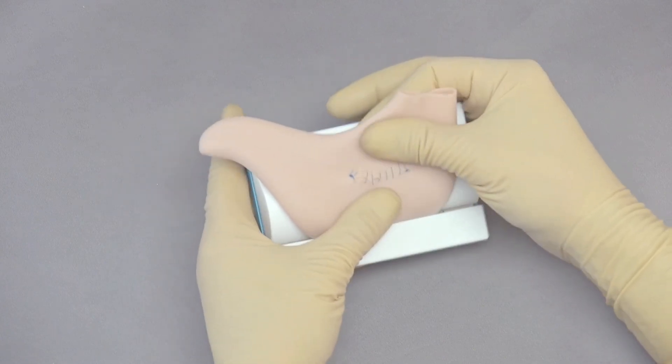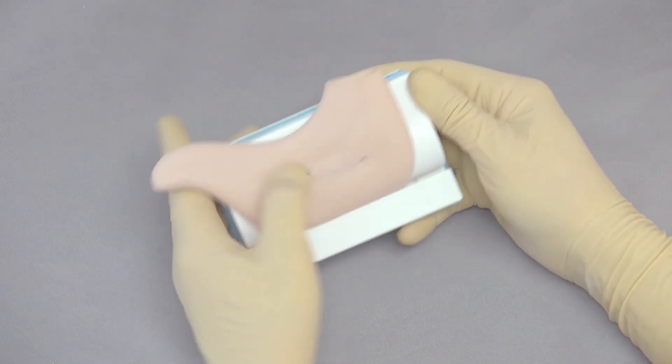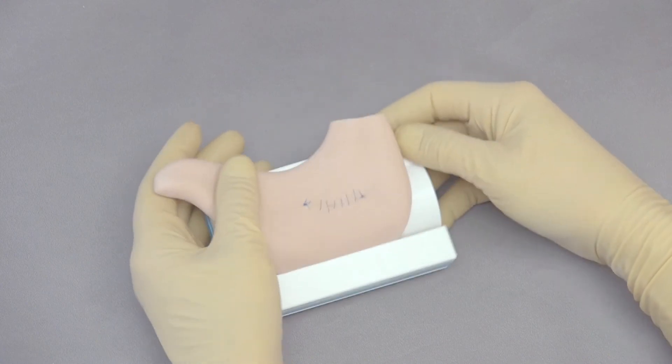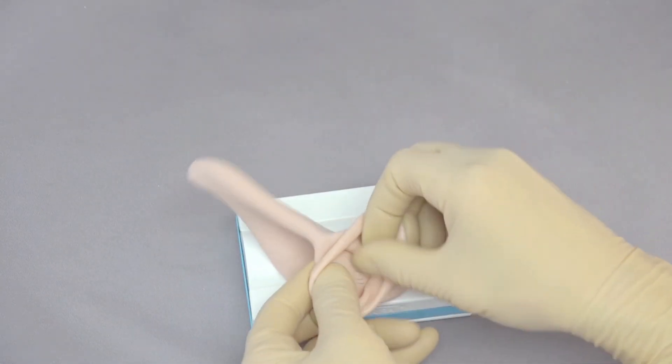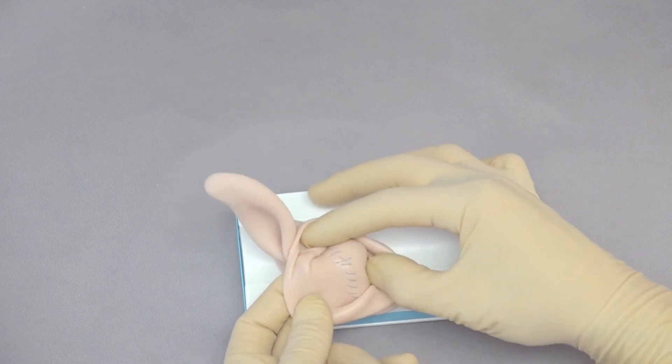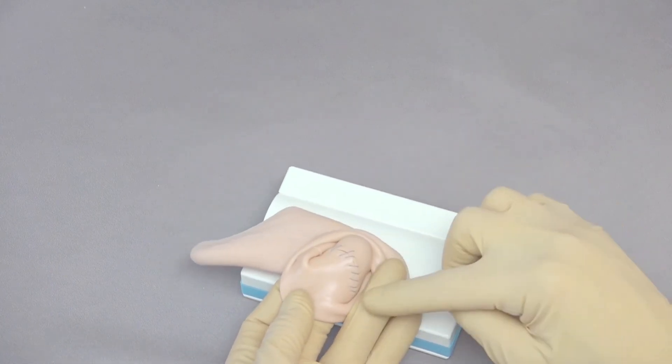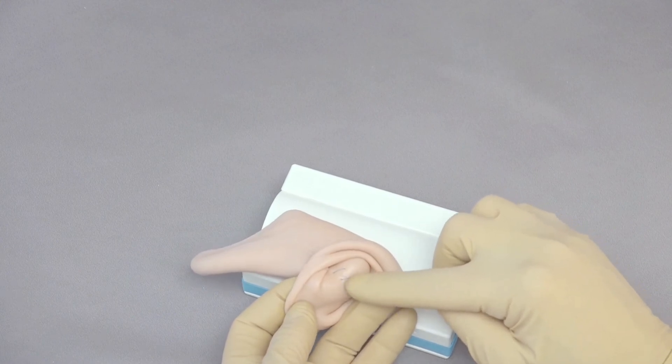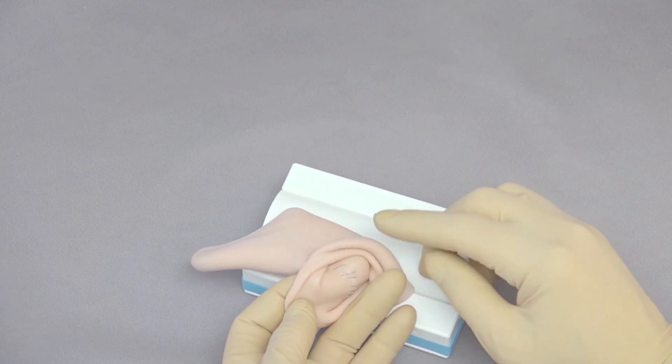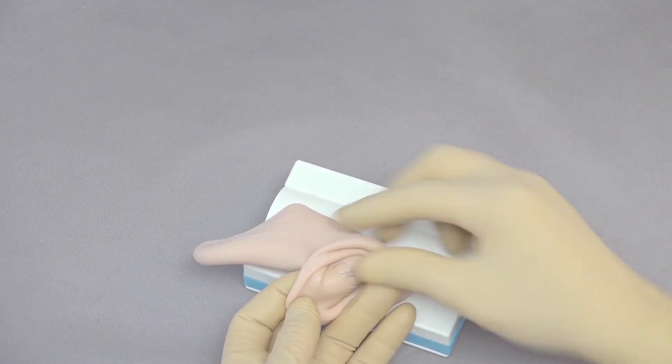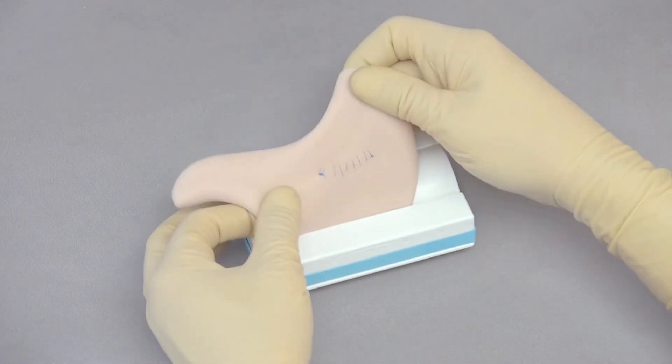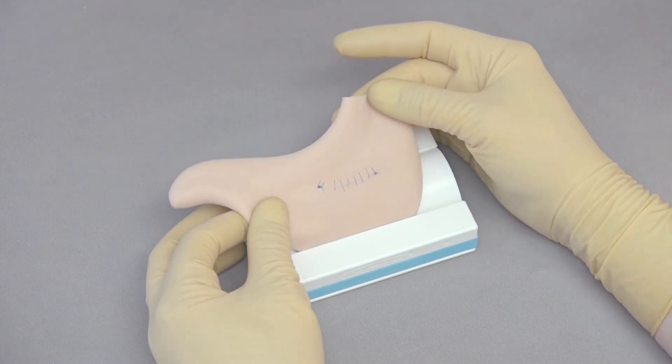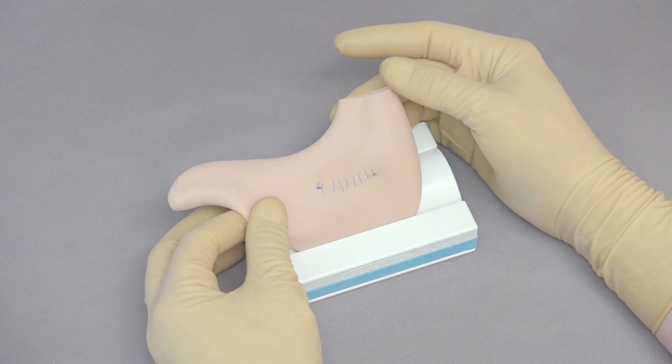It comes together nicely. It should be water tight and fluid tight, but what's really fun about this model is that what I can do now is actually come through and see what it looks like on the inside as well. You can appreciate that these bites were much better as far as evenness than I got a little bit greedy right at the end, where I'm getting close to the end of the incision. That was a little bit wider on the inside than it was on the outside. The nice part about this model is that you can look at both sides to determine the effectiveness of your suture placement.